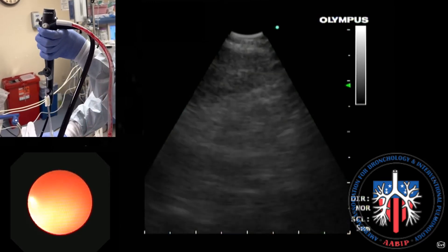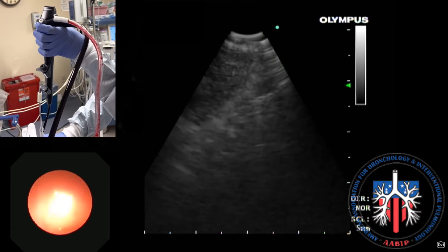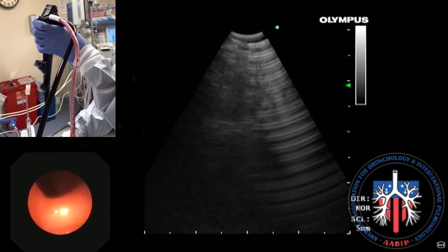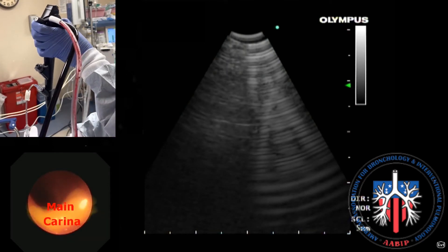Station 7 can also be visualized from the left main stem bronchus looking towards the carina. It extends from the takeoff of the left lower lobe up to the main carina.